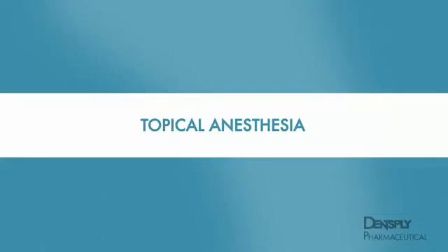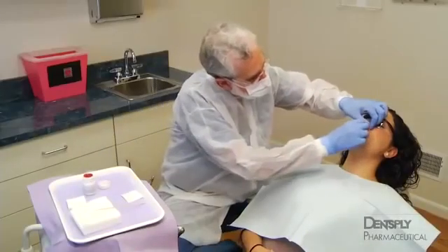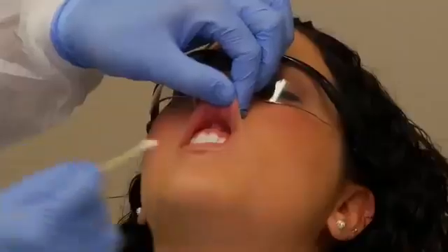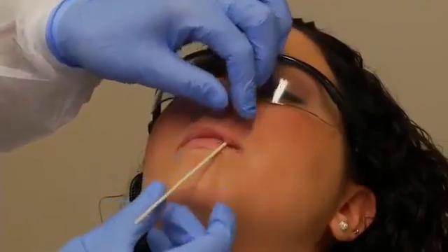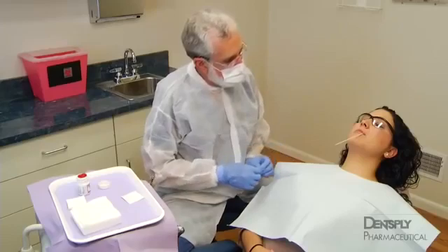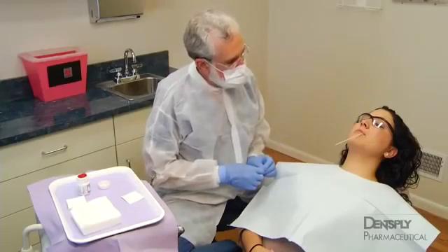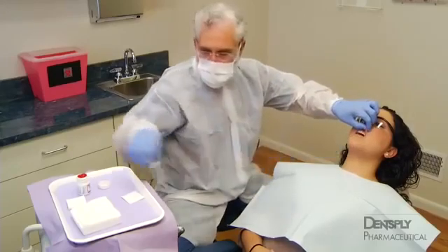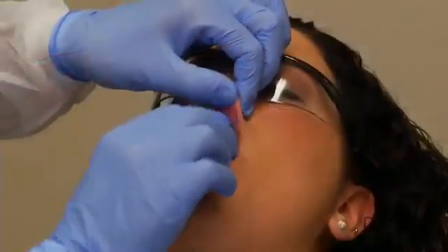Topical anesthesia. To desensitize the mucosa before needle insertion, a topical anesthetic is applied to the injection site. The mucosa is first dried with a sterile gauze and a small amount of topical anesthetic is then placed with a cotton-tipped applicator. After the anesthetic agent has had time to take effect, it will result in mucosal anesthesia to a depth of 2 to 3 millimeters. Residual anesthetic and surface debris are removed with a sterile gauze immediately before injection.